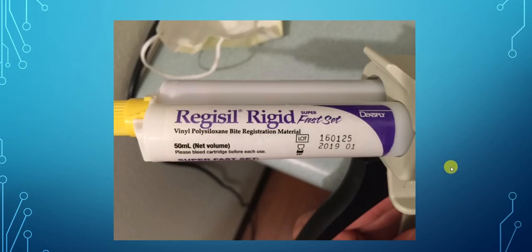I like to use Regisil Rigid. You could use any kind of fast-set polyvinyl siloxane — like Blu-Mousse, any of these would work. Just Regisil is the one I prefer to use.